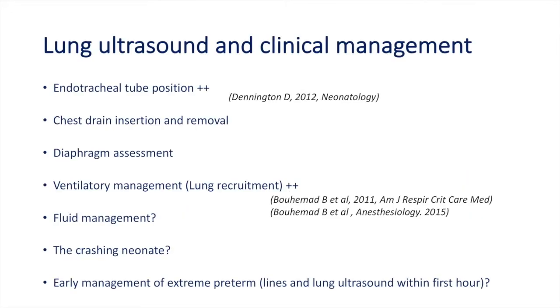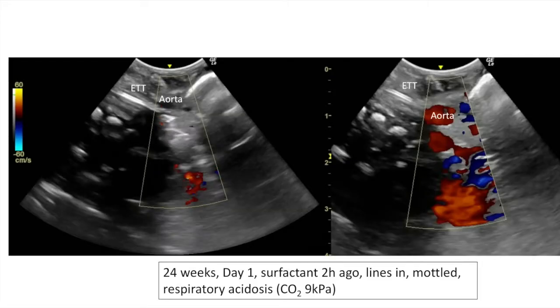Other indications where lung ultrasound can be useful in your management are endotracheal tube position, chest drain insertion and removal, diaphragm assessment, ventilatory management, including lung recruitment, fluid management, crashing neonates, and early management of the extreme preterm, especially during the golden hour.